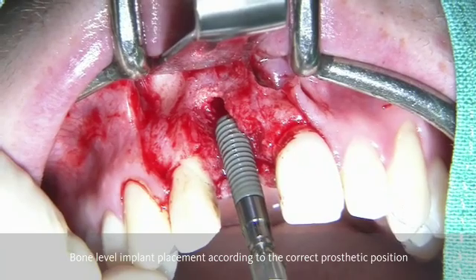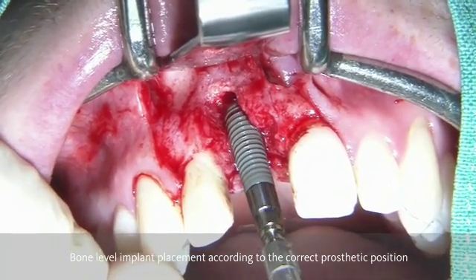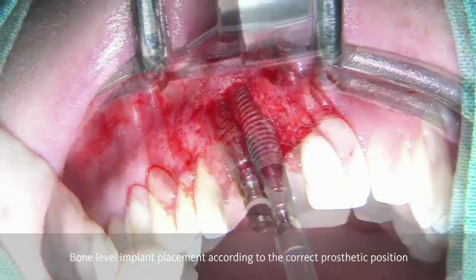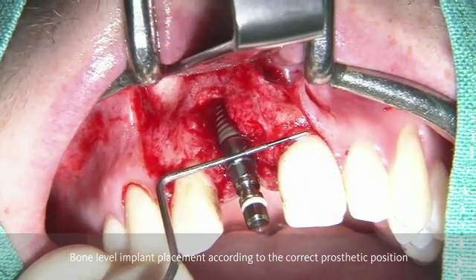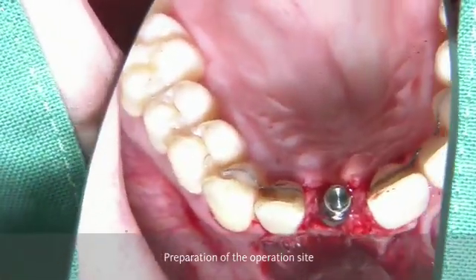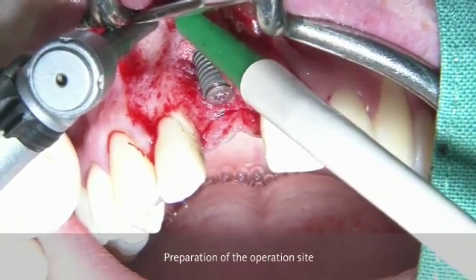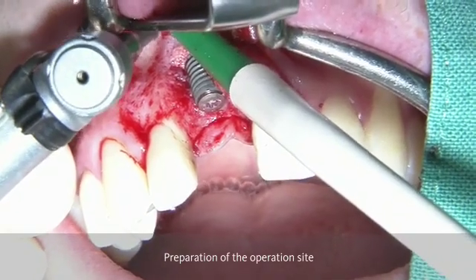After completing the osteotomy, the implant is going to be inserted according to the correct prosthetic position. After having the implant in place, we check the vertical position — we want to be about 2.5 to 3 mm away from the future crown margin. After the implant has been placed, we can see that we have a dehiscence defect. Now we need to regenerate this defect.